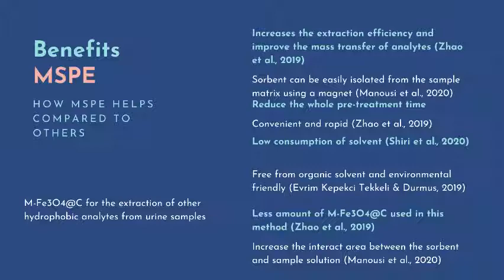Next, this developed method was convenient and rapid as the whole procedure of MSPE could be completed within 15 minutes. This method showed a great potential in sample preparation. Additionally, compared with liquid-liquid microextraction, highly toxic chlorinated reagent was not involved, which enhances the simplicity of operation. This method is free from organic solvent and environmentally friendly, where preparation of the adsorbent is only conducted in a mortar.